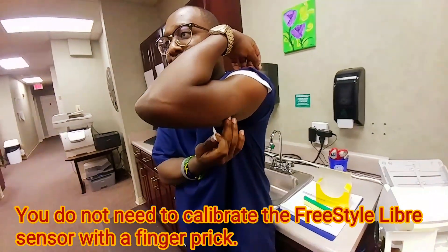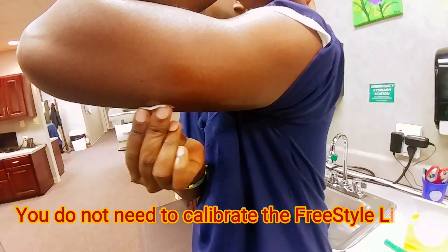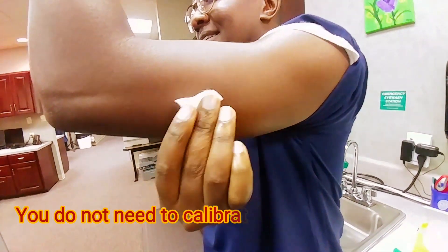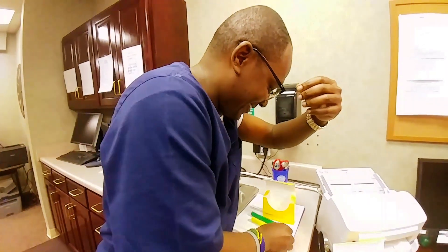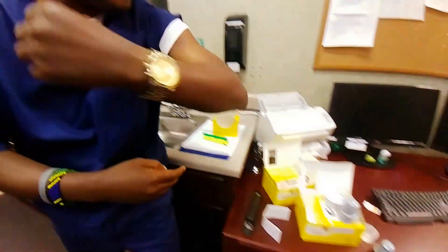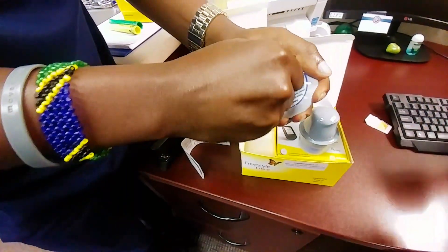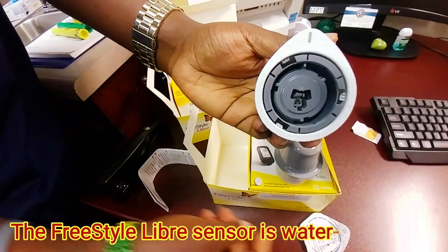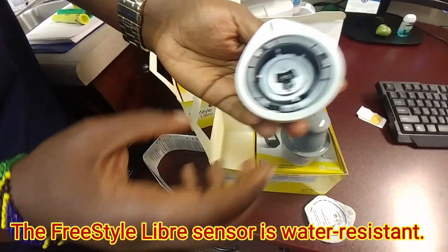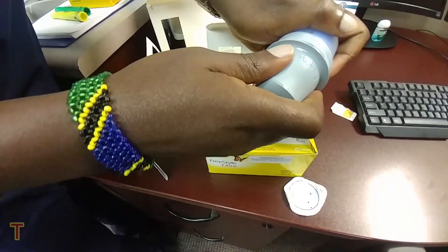So right under there — there you go, see the bones right there. He's going to clean off with the alcohol. Good, I think you're clean. And then he's going to let it dry. While it's drying, go ahead and open these two. In here, this is where the sensor is. And then the applicator — he's going to twist it and take it over.